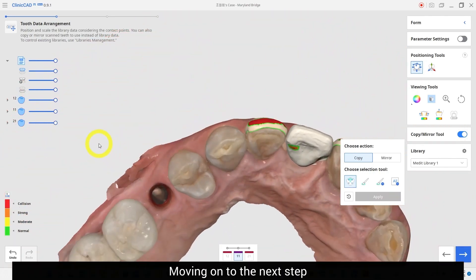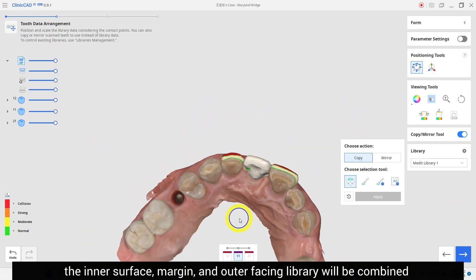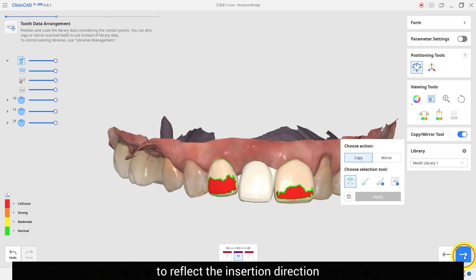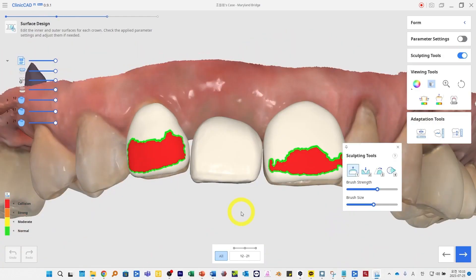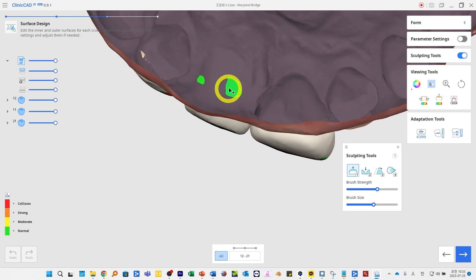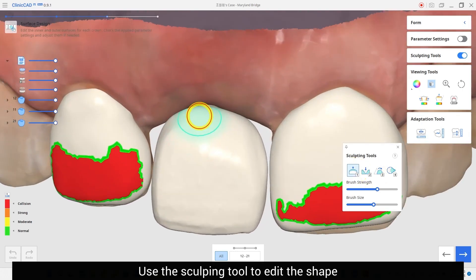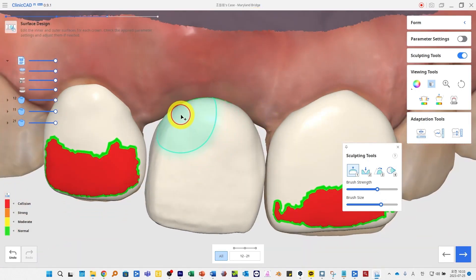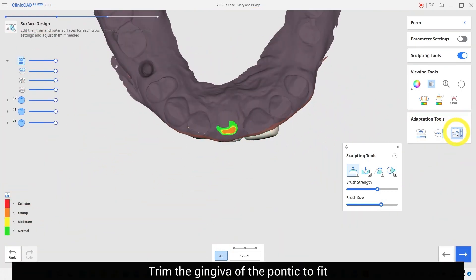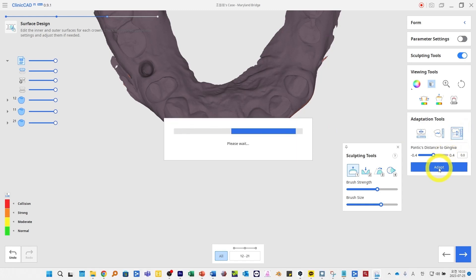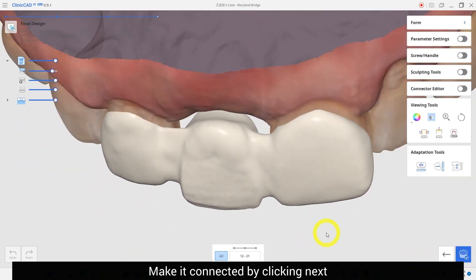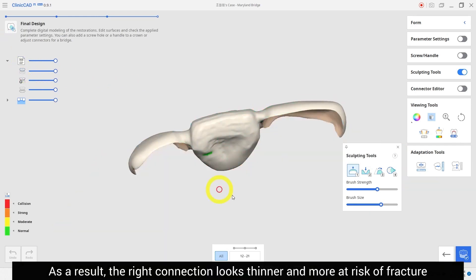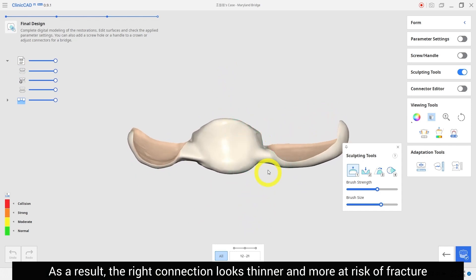Moving on to the next step, the inner surface margin and outer facing library will be combined to reflect the insertion direction. Use the sculpting tool to edit the shape. Trim the gingival of the pontic to fit. Make it connected by clicking next. As a result, the right connection looks thinner and more at risk of fracture.